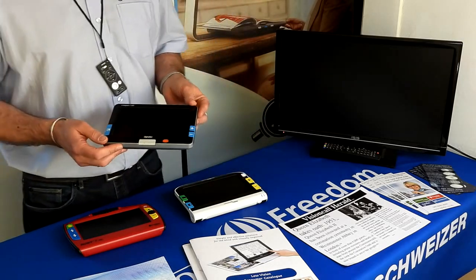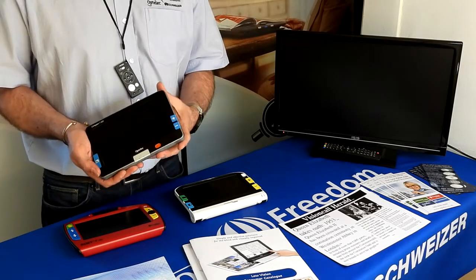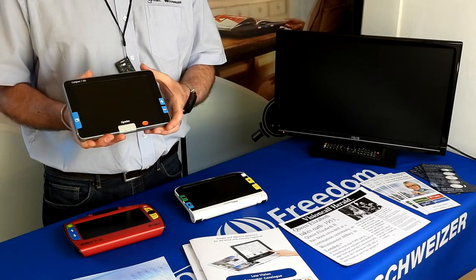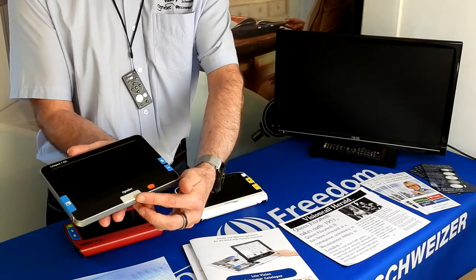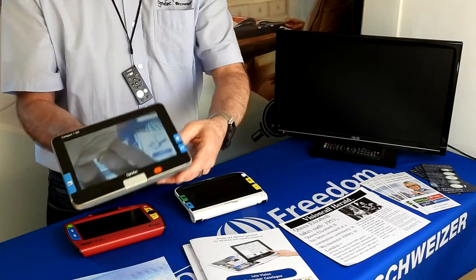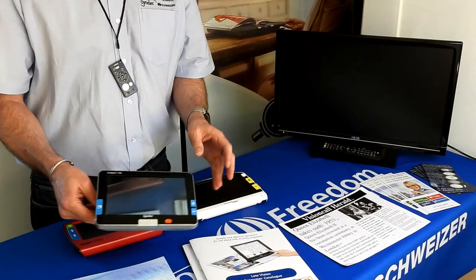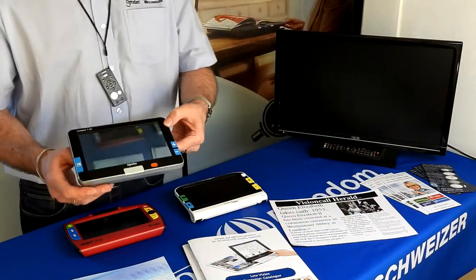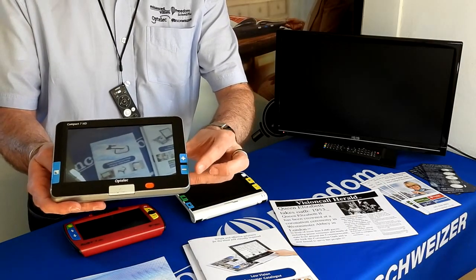The Compact 7 is our longest established portable video magnifier. It has a high definition camera and very minimalistic buttons. It's a clamshell design, as all three are. You press the bottom button to open the device and it comes on straight away with the camera in focus. All three machines are set to auto focus on whatever reading material you place on them. The key layout is very similar across all — tactile buttons with a plus and minus key to change magnification.